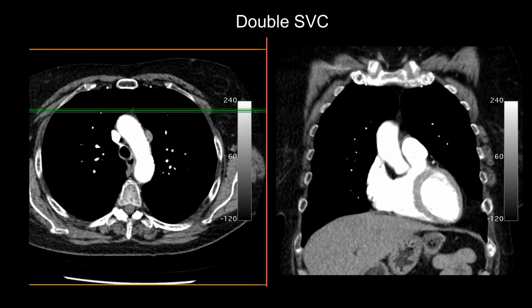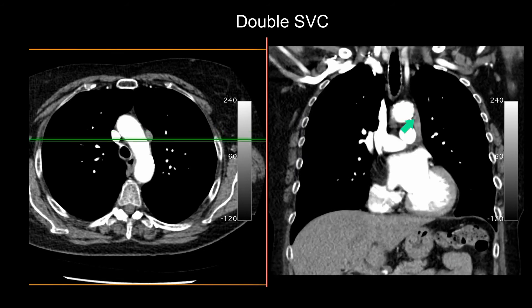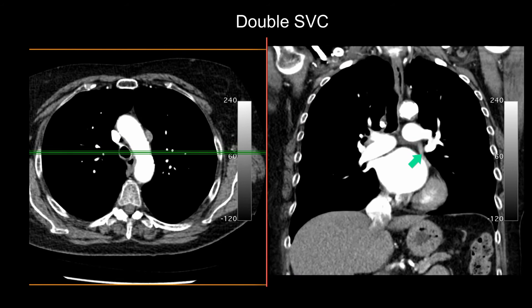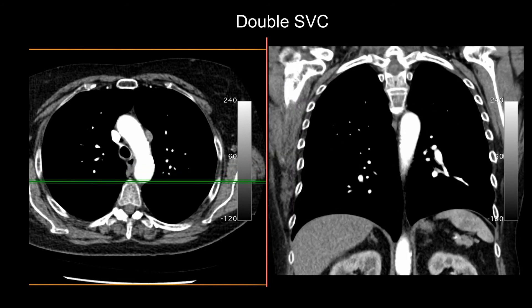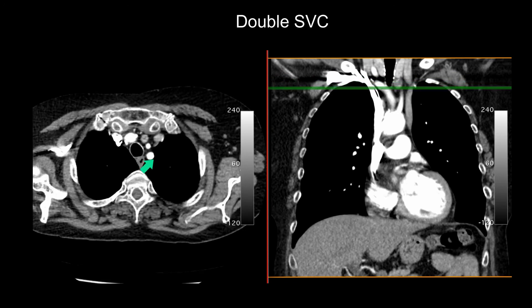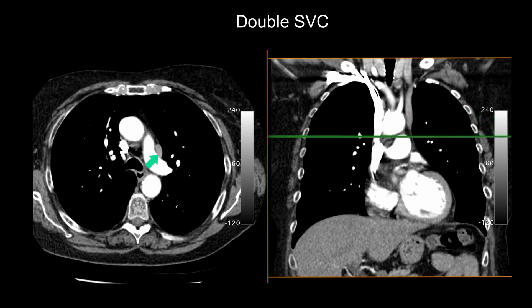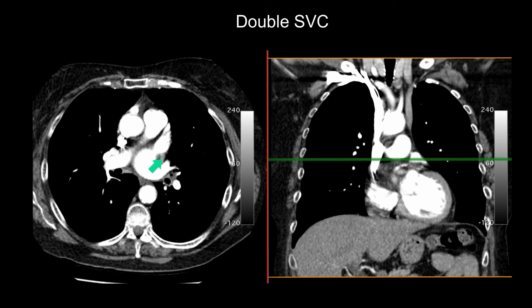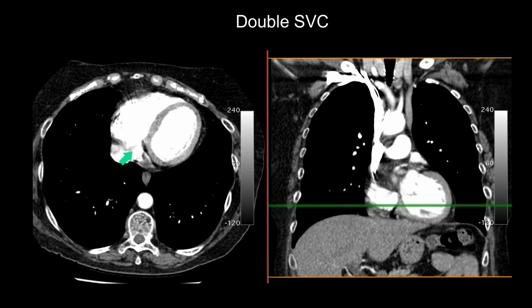Left-sided SVC. It is much more common to have a double SVC than to have a solitary left SVC. Here is a left-sided SVC in a patient who also has a right-sided SVC. You can see that it is going behind the left atrium and joining up to the coronary sinus, which then drains into the right atrium. Here is the axial aspect. There is the left SVC. There is the right SVC. It goes lateral to the pulmonary trunk, jumps behind the left atrium, and joins to the coronary sinus which then drains into the right atrium.